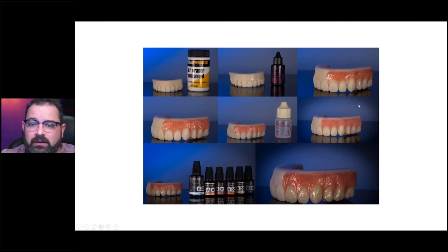On monolithic restorations, it's pretty much the same thing. The only difference is that at the end you're going to place OptiGlaze Color to give life to your restoration, because when you print teeth as-is, they generally look pretty dull and you want to add a little bit of pizzazz to it.